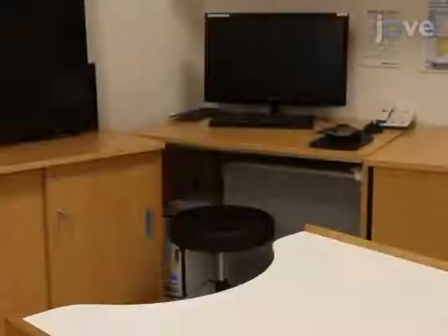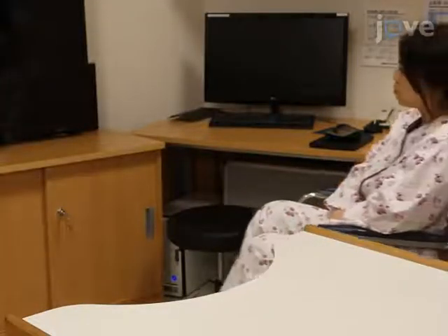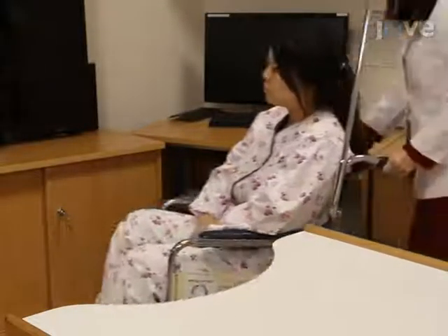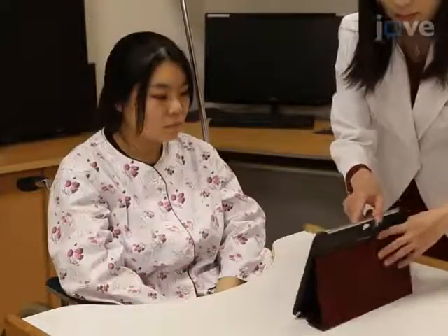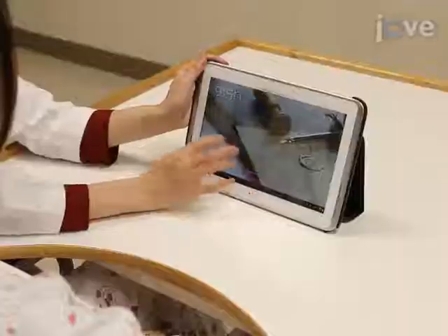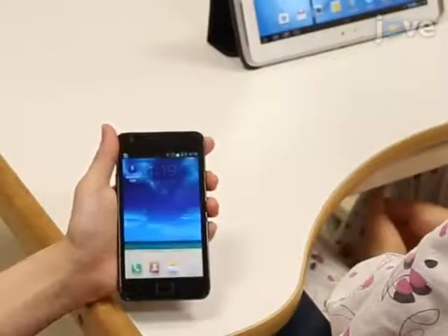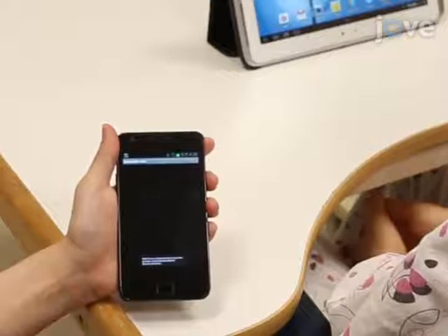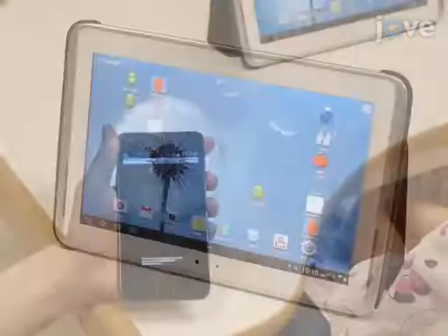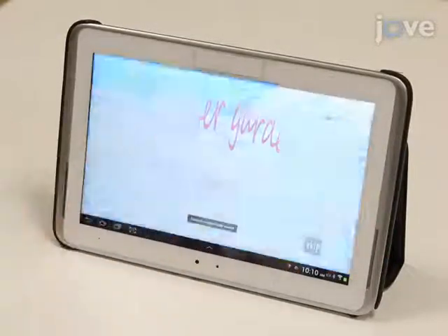Begin by escorting the participant into the therapy room and have them sit at the desk. Place the tablet PC on the desk and turn it on. Next, turn on the smartphone as well as the short-distance wireless connection on the smartphone. Choose the game application on the tablet by touching the screen.